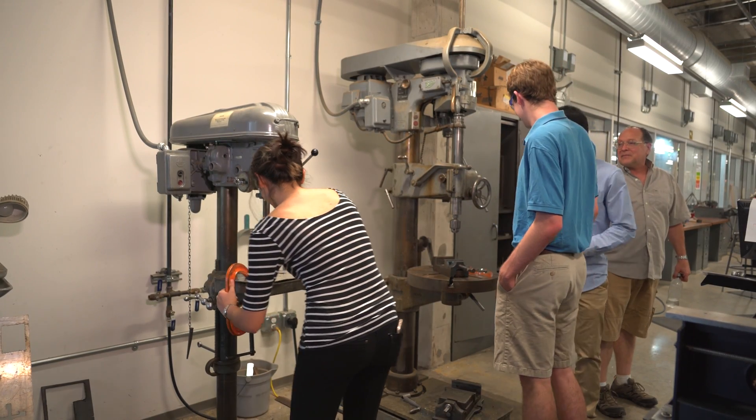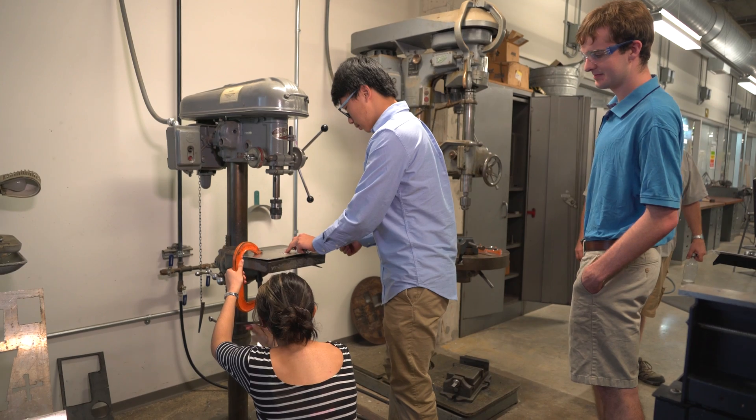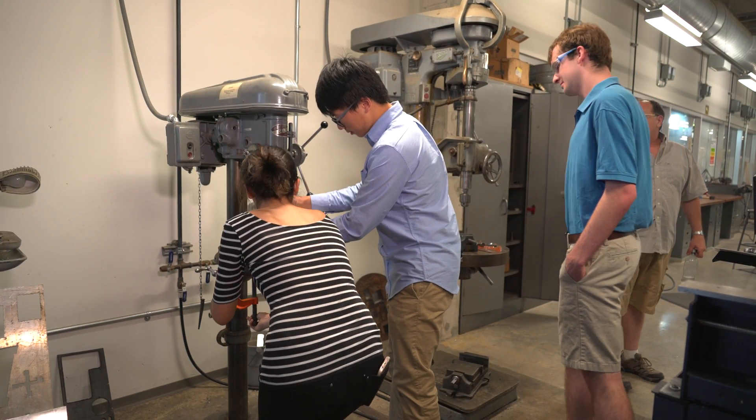I had never used power tools before — we had some more experienced members in the group, but for this class you don't have to have any prior engineering experience. I was learning stuff for the first time and we just dived right into making wood prototypes with drills and all sorts of power tools, and then going into metal working. It was really exciting — I learned a ton of good building experience.